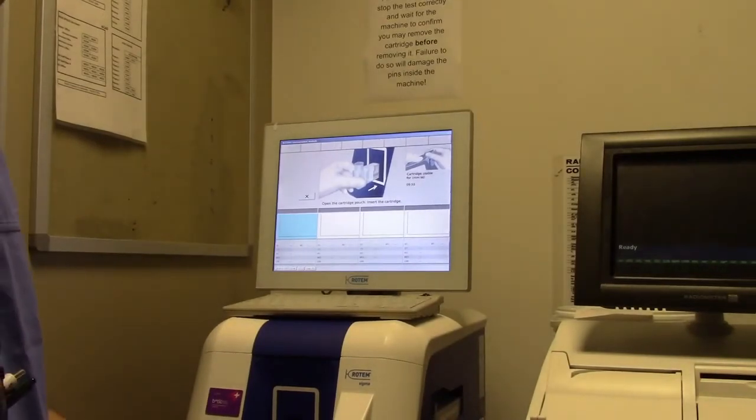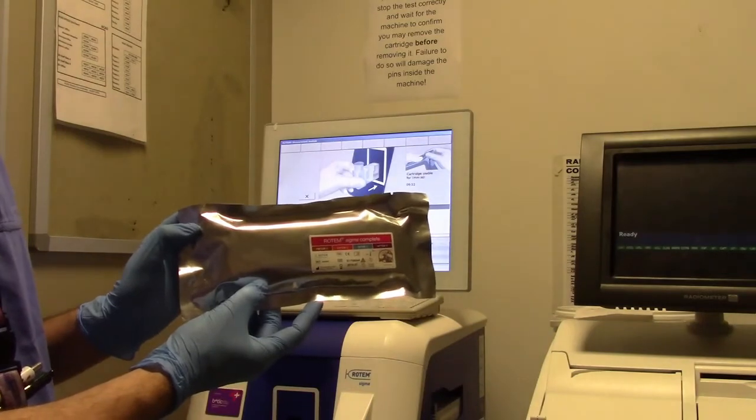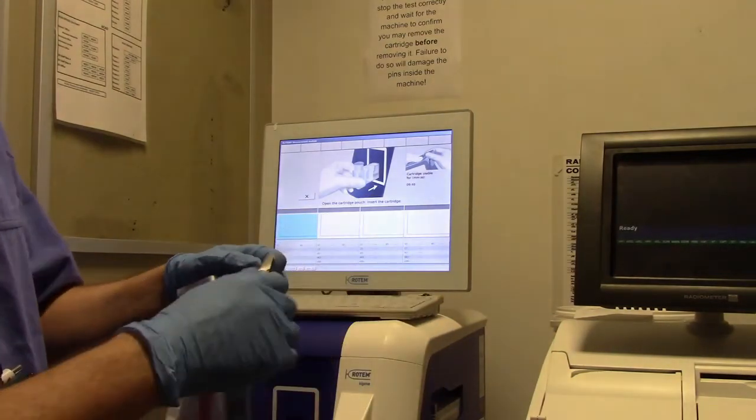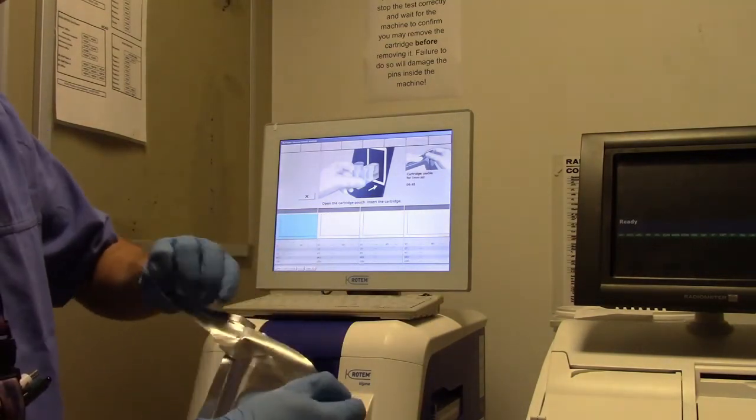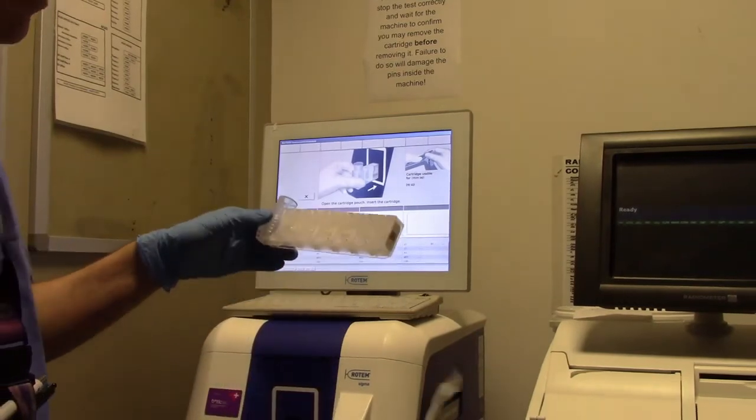This is the cartridge we are using. It is a single test cartridge. Open the cartridge gently, ensuring it is not dropped, and gently insert the cartridge.